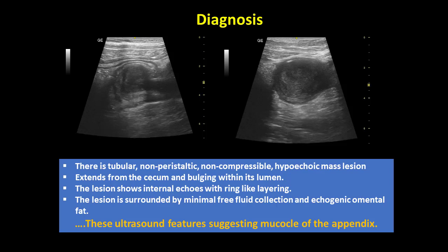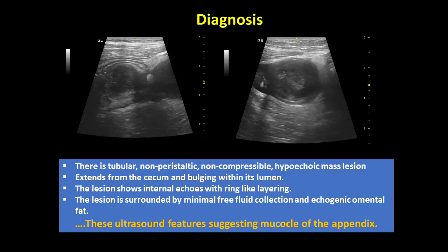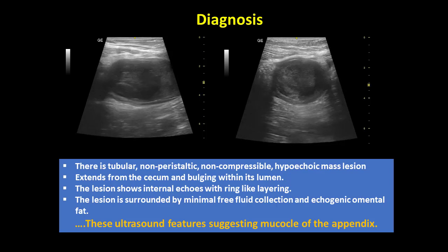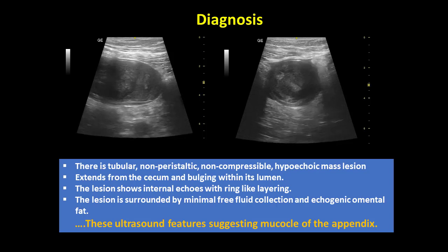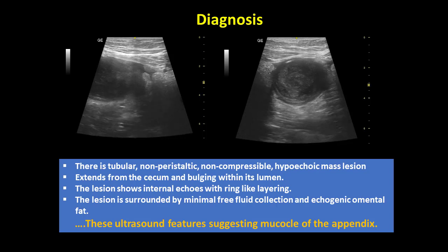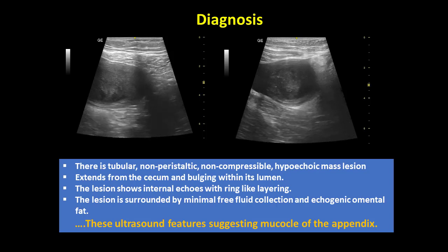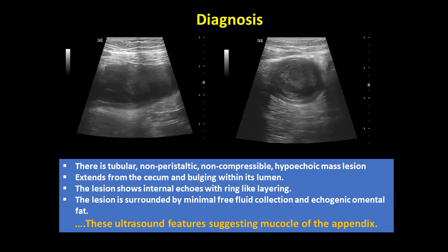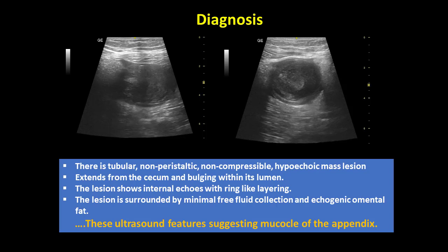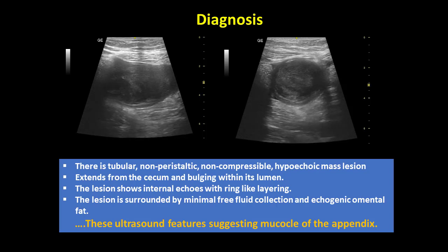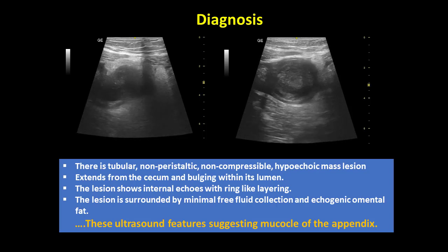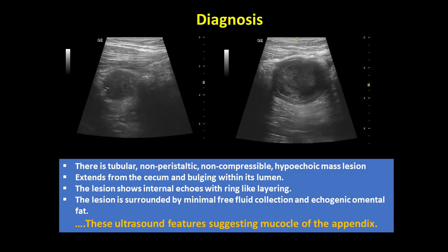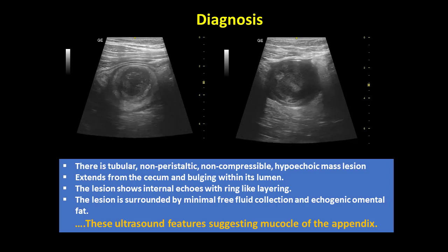As you can see, there is a tubular, blind-ended, non-peristaltic, non-compressible hypoechoic mass lesion. It extends from the cecum and bulges within the cecal lumen. The lesion shows internal echoes with layering and is surrounded by minimal free fluid collection and echogenic omental fat. Color Doppler examination revealed no internal vascularity.